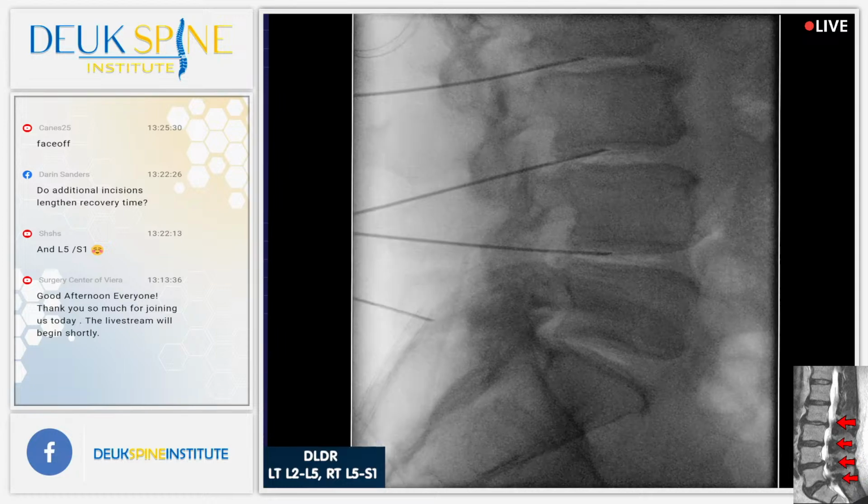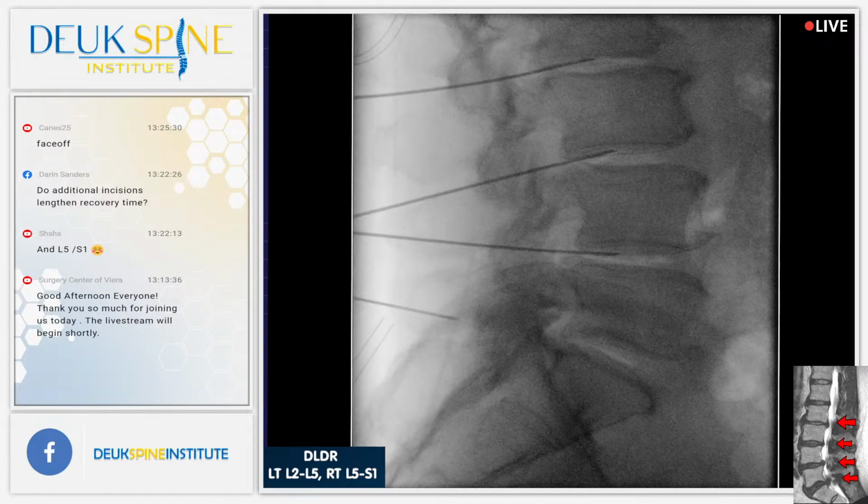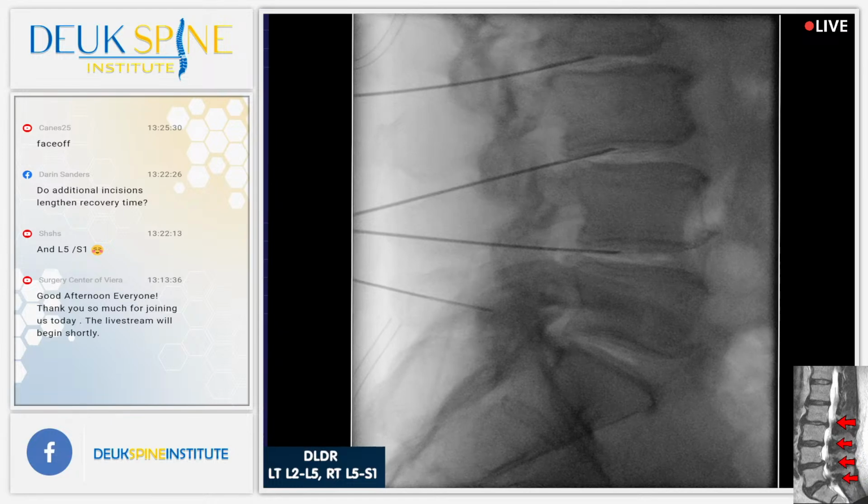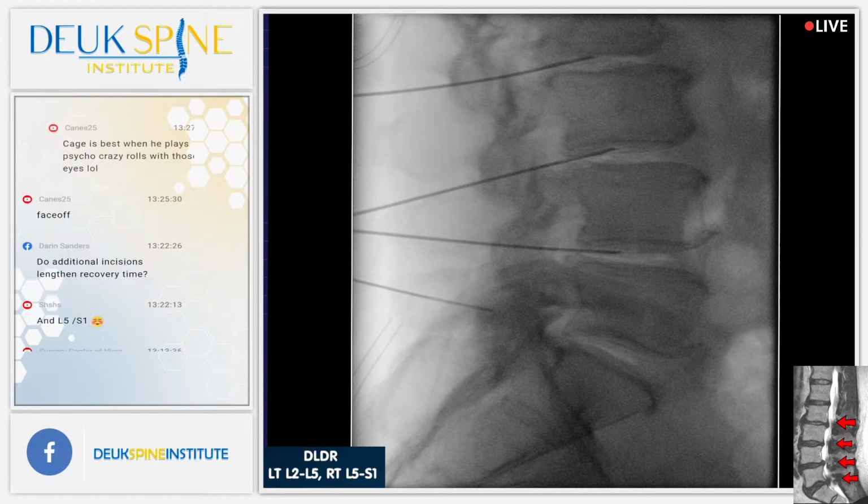Shot. Jeez. Might be able to come a little bit higher. Shot. Wow. I'm just hitting every piece of bone you can ever imagine over here. Shot. A lot of bone spurs. That's interesting. I wonder if I'm lateral.